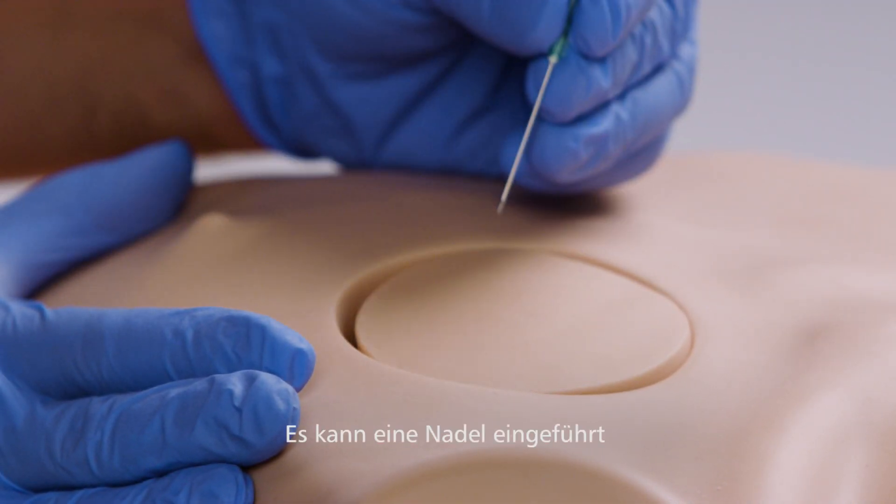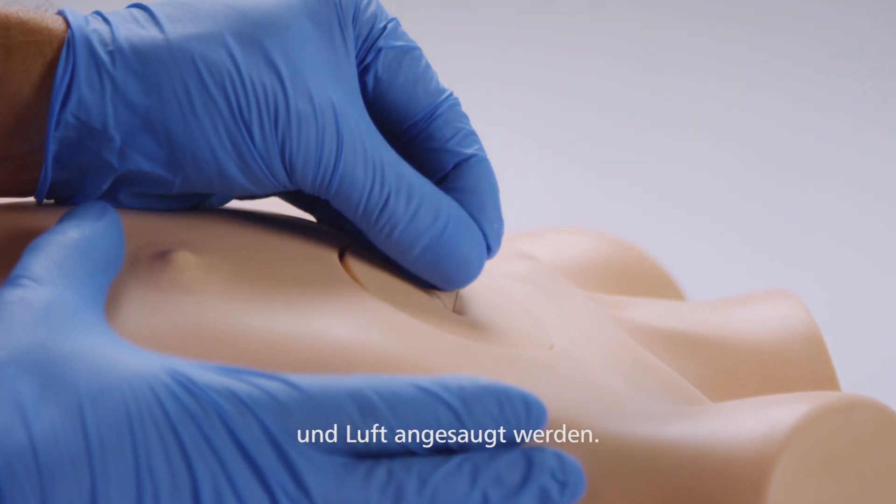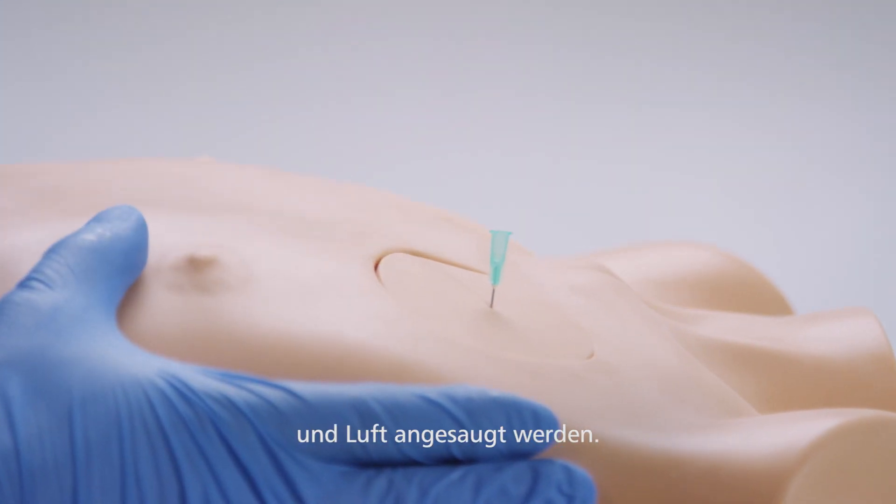Using the needle decompression pad, a needle can be inserted and air aspirated to perform needle decompression.